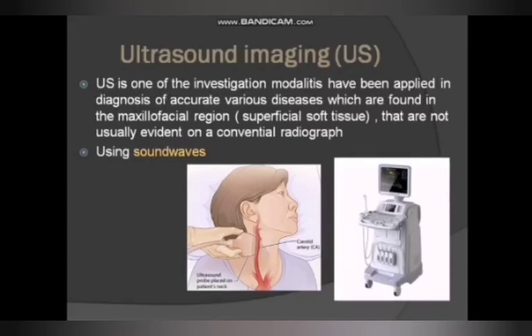Ultrasound imaging, or US. Ultrasound is one of the investigation modalities, a non-invasive and widely available diagnostic tool that has been applied in the diagnosis of various diseases in the maxillofacial region, especially superficial soft tissue, such as inflammatory swellings and lymph node pathologies. Ultrasound uses sound waves that pass through tissue of different acoustic impedance.